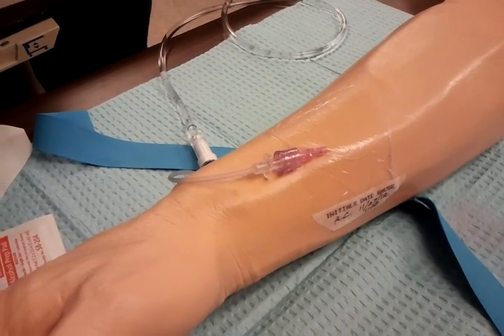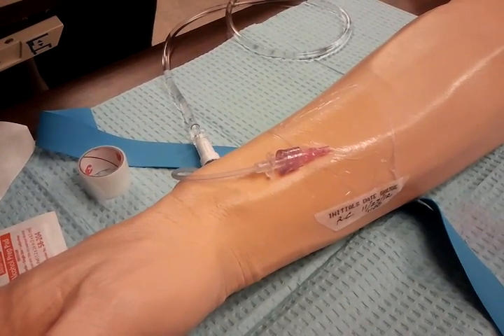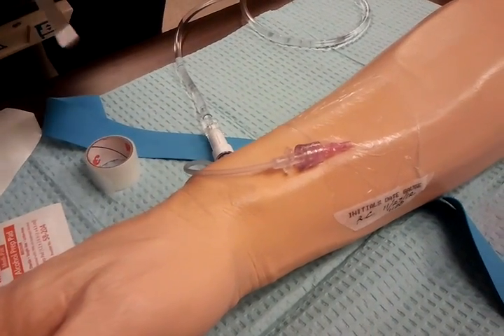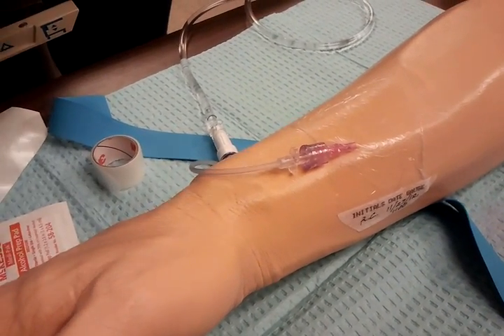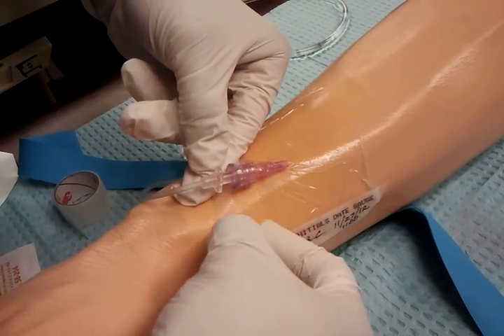Instruct client on how to protect site and avoid dislodging catheter. Dispose of any uncapped needles. Explain signs and symptoms of infiltration or phlebitis, and document procedure appropriately.